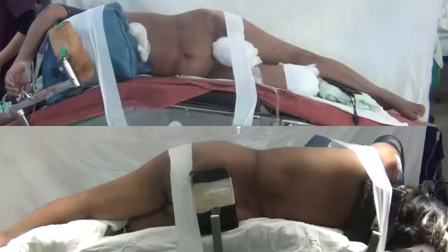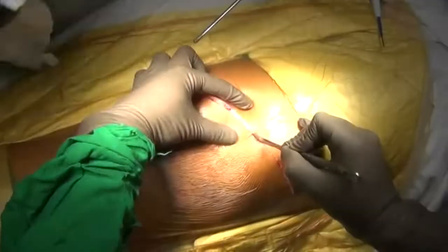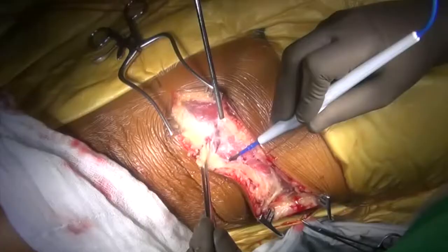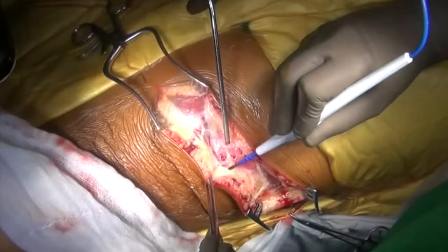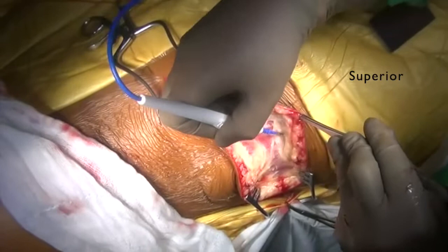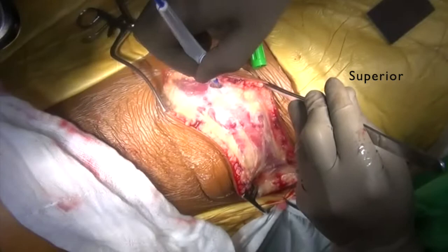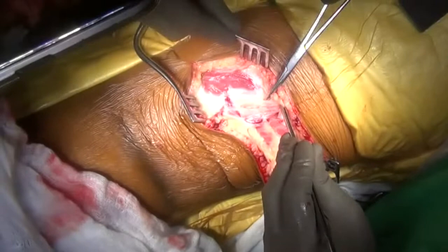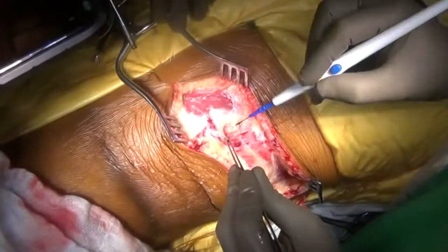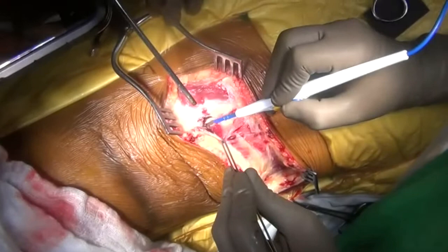With the patient in the lateral position, the incision is along the 10th rib, which gives good enough exposure of the lower thoracic vertebrae. After cutting the skin and subcutaneous tissue, I usually raise a little subcutaneous flap to identify the muscles and demarcate them clearly to aid in good suturing at the end of surgery. I identify the anterior margin of the latissimus dorsi muscle and separate it from the underlying ribs and intercostal muscles.